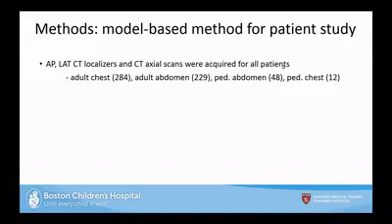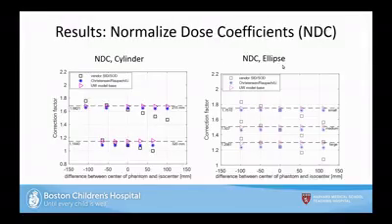Yeah. So what I plotted there on the graph was the distance between the center of the patient. Actually, we can go back to those graphs. Yeah, the center of the phantom and the isocenter. So you're doing like a subtraction. So it's like the table height minus half of the AP measurement. In this case, we assume that the AP, we don't do a magnification correction for that AP measurement. We just take that one from the image. So that's the only assumption that we make.